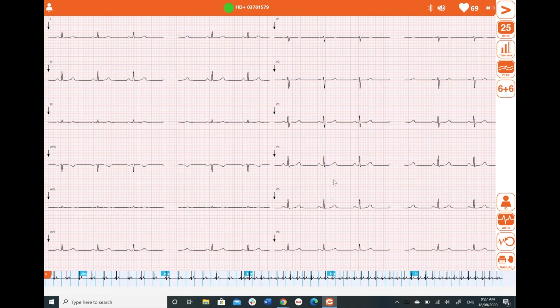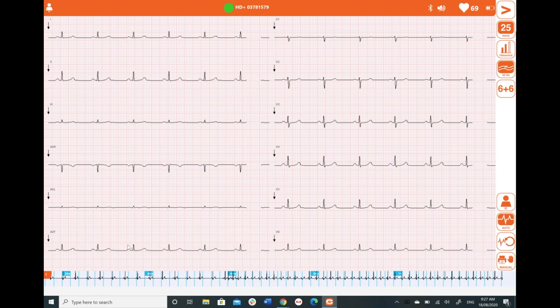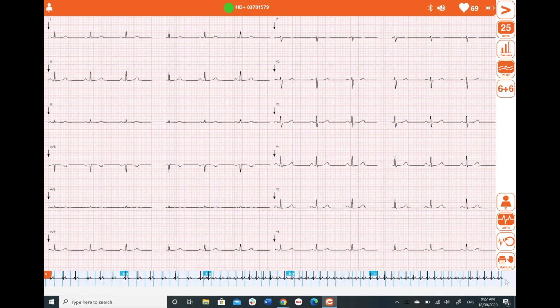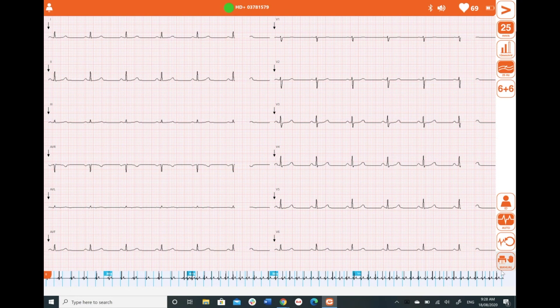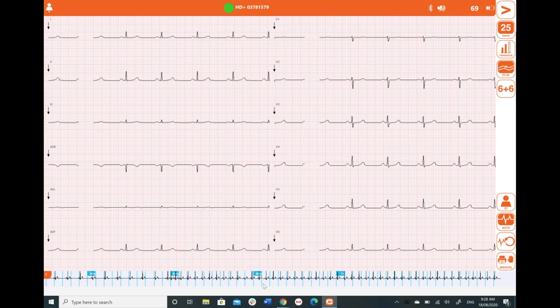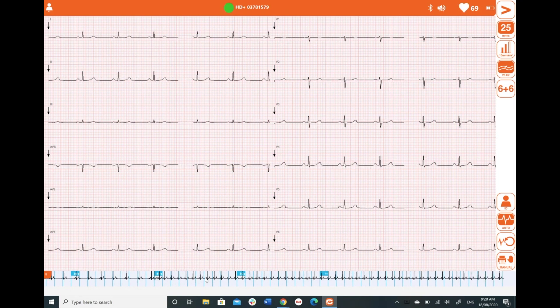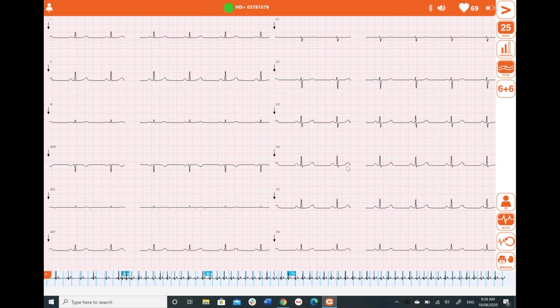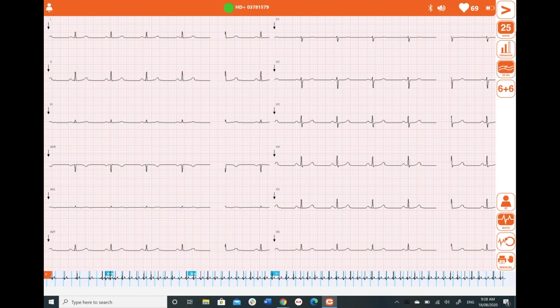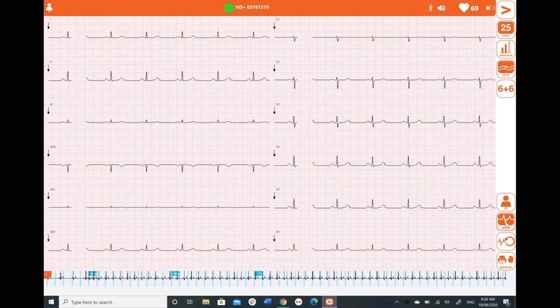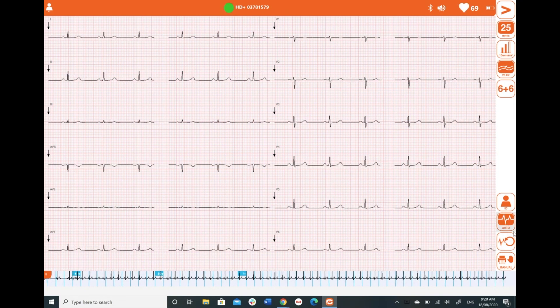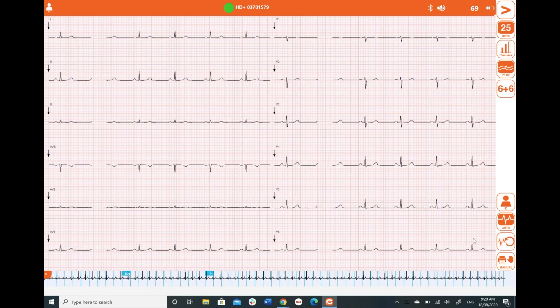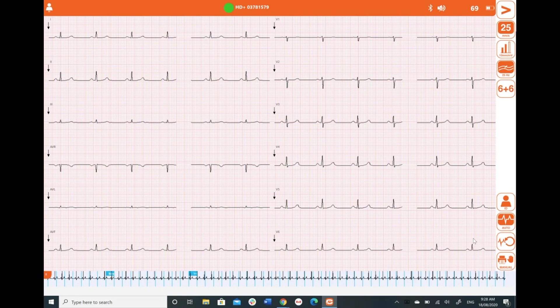What I'm going to take you through now is a very nice feature of this device — the review function. This rhythm strip down the bottom is going to continually monitor our patient for up to half an hour, and has the ability to capture more than one ECG report and save that for one patient. I'm going to throw this into an arrhythmia now.